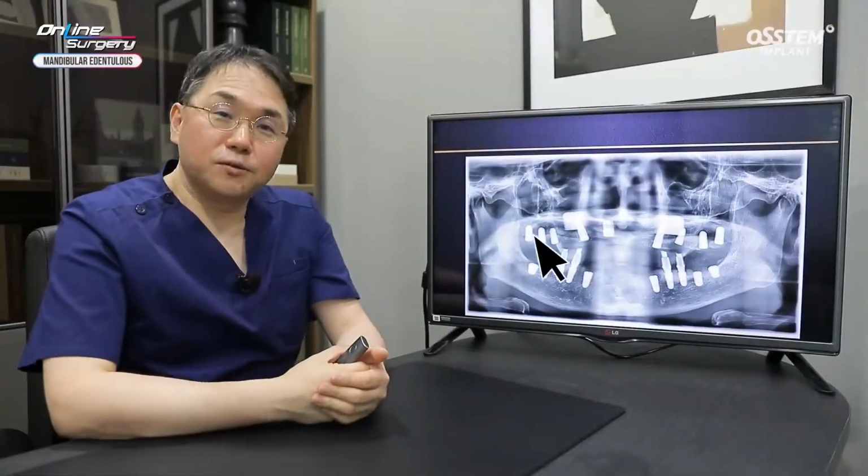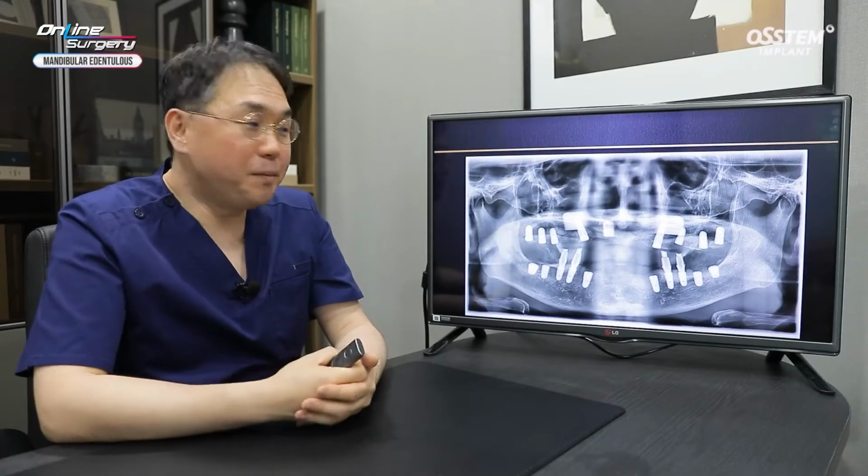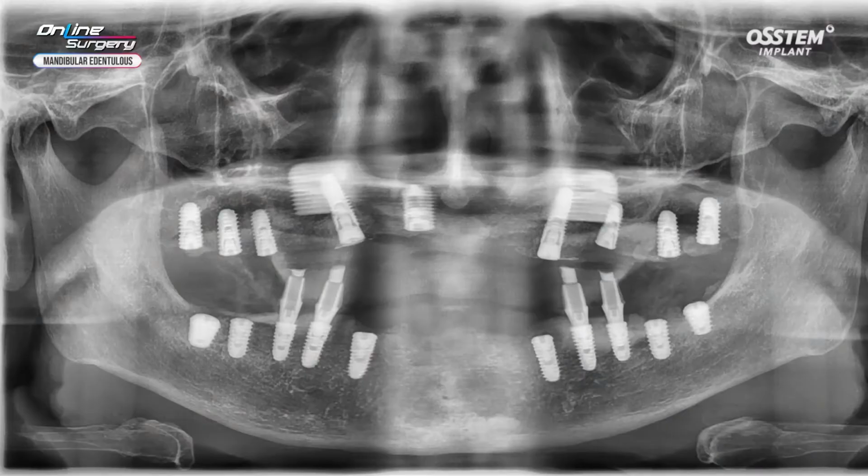Now, you have watched the surgical clip. This is the post-op panoramic image. 10 implants have been placed as planned, number 4 and number 5 on both sides. Transfer abutment and prefabricated PMMA bridge have been used for immediate loading.